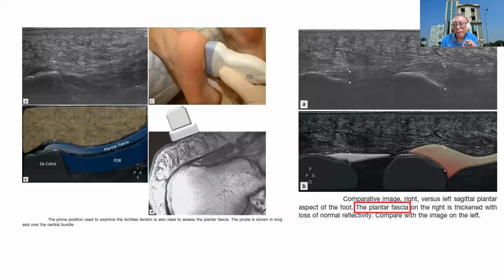If you are injecting PRP, first do multiple tenotomy, puncturing the fascia multiple times. So you are creating injury, which will cause neovascularization, and there will be healing. And then inject PRP within the substance of the plantar fascia where there is a problem.